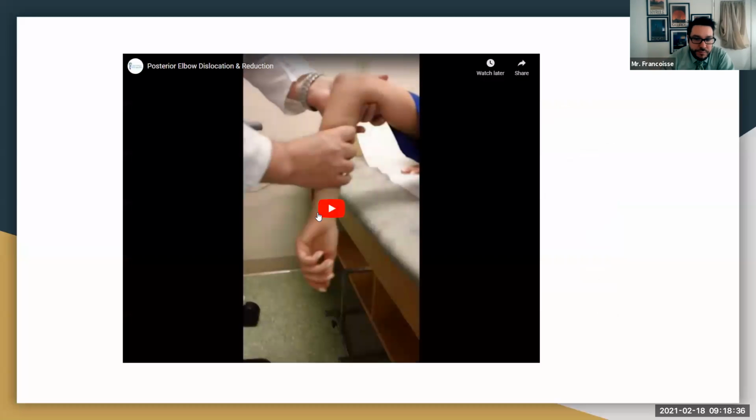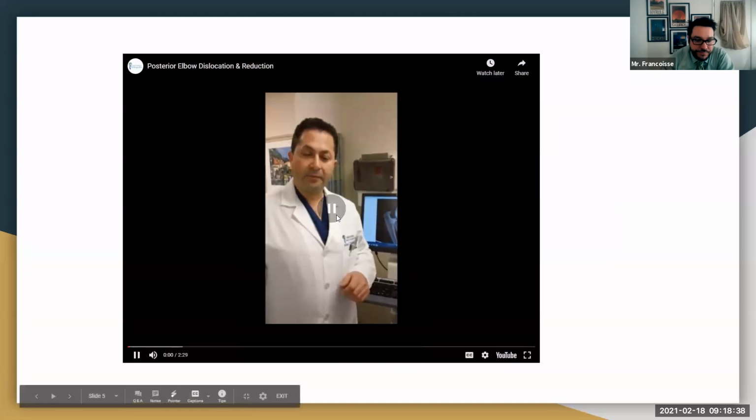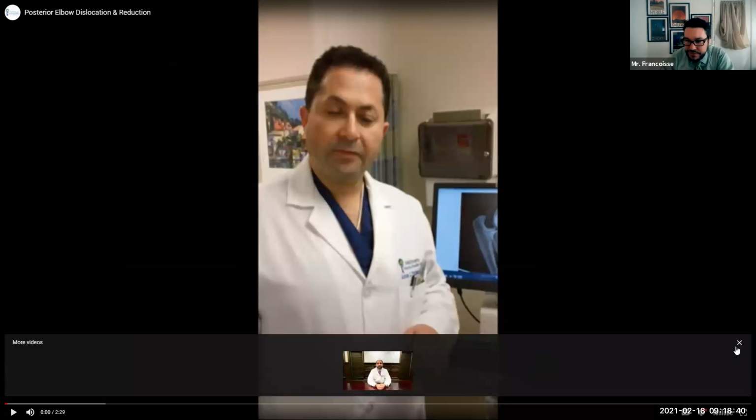All right, so we're going to look here at a short little video. I know that they should have recorded the other way, but pet peeve, right? The vertical videos. I want you to look at, so this is how they would treat an elbow dislocation. So how do we treat a dislocated elbow? We have a fracture, we know we add a cast, but I think this is kind of interesting. I want you to look at this x-ray.